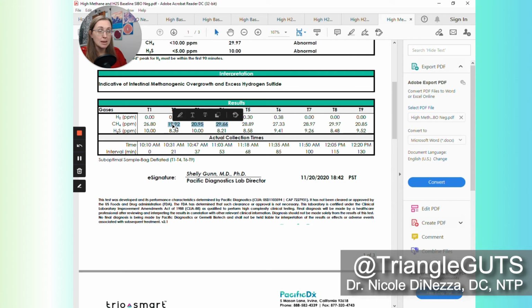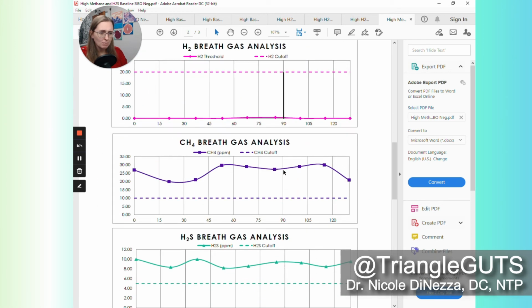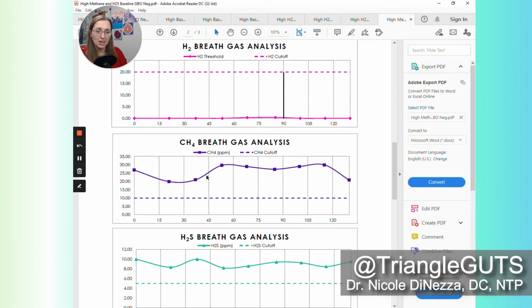methane SIMO, not SIBO because it's not bacteria, but I would call this SIMO because we do get a jump in the small intestine territory well before the 90-minute mark. We get that jump, and it is right about 10 parts per million. So that does meet diagnostic criteria for methane overgrowth, as well as SIMO, small intestinal methanogen overgrowth. Now, on the contrary, and this could be where all of the hydrogen gas is going, by the way, because again, your methane producers are going to take the hydrogen gas and make it into CH4, methane.